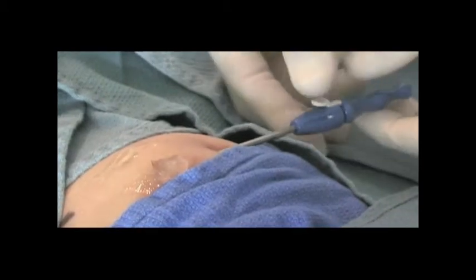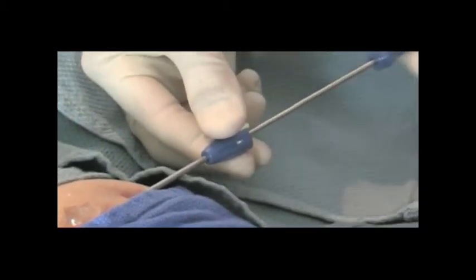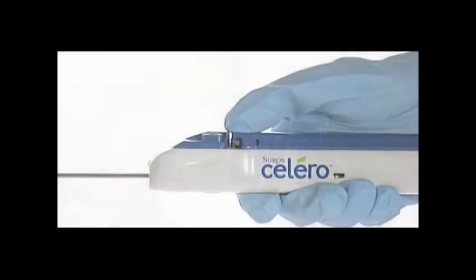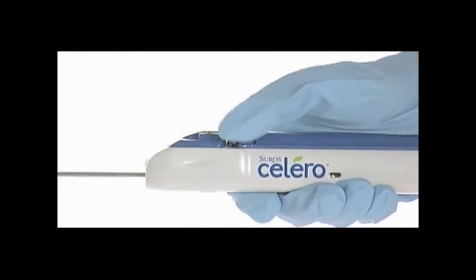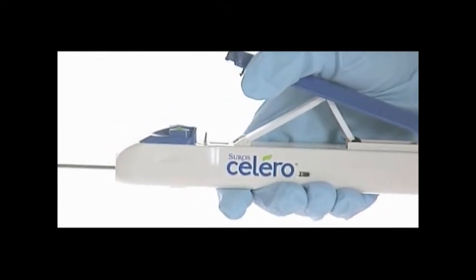Leaving the sheath in place, depress the white latch attached to the blue hub that allows release and removal of the stylet. Remove the Solero from the packaging. Release the Solero actuating lever by depressing the black latch located on the left top side of the device.